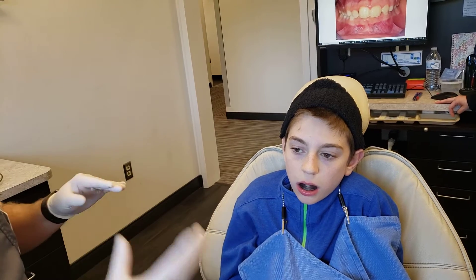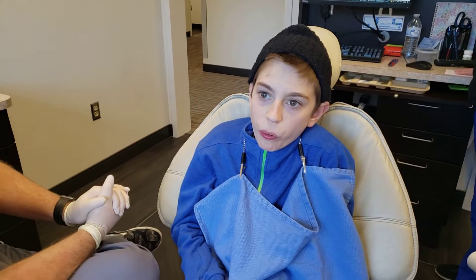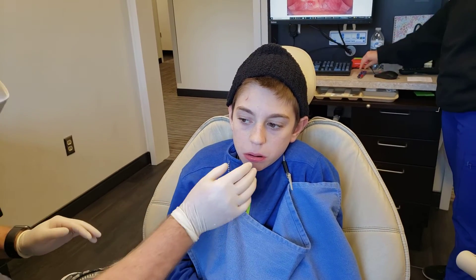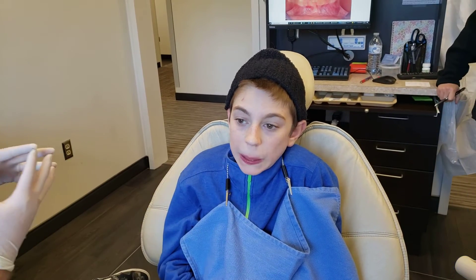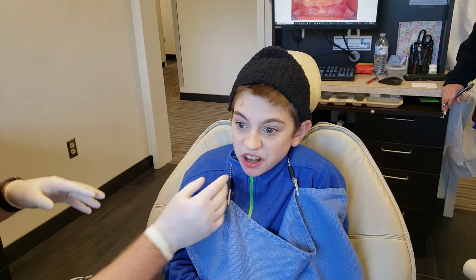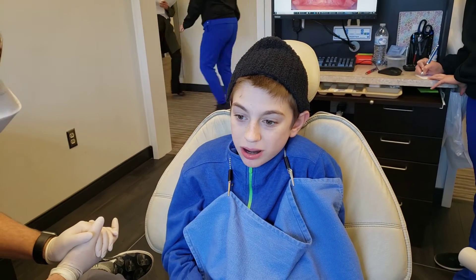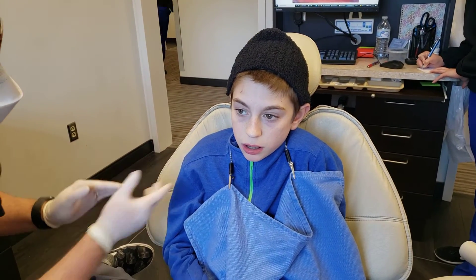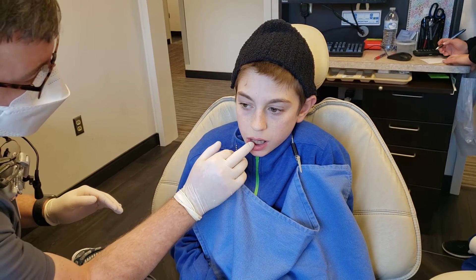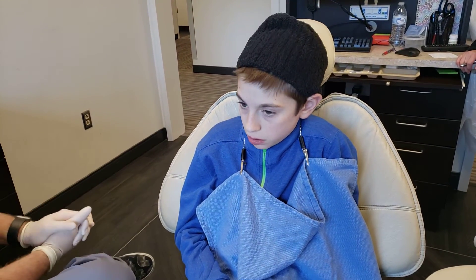We want to get him in the habit of wearing this every single day for a certain amount of time. He really enjoys Minecraft and he'll wear it during Minecraft. The key is you have to keep your bottom teeth inside of it — top and bottom teeth stay inside the trays the whole time. After about two days, wearing it like that is not going to hurt anymore.